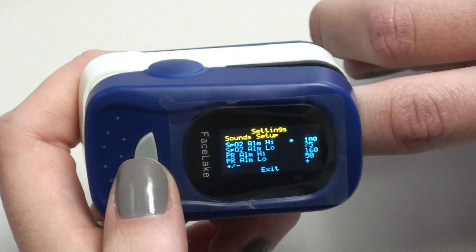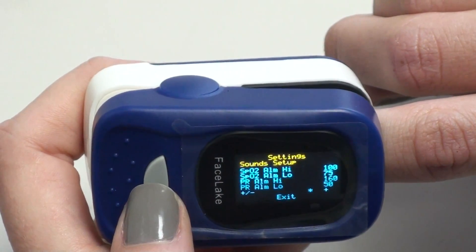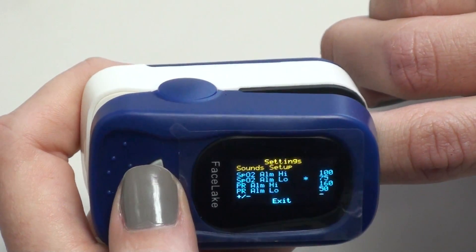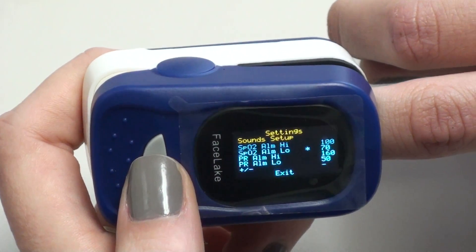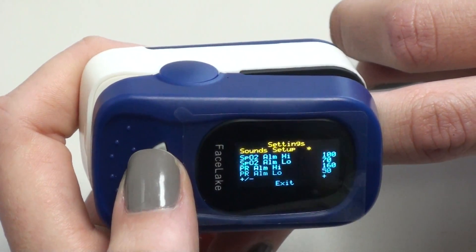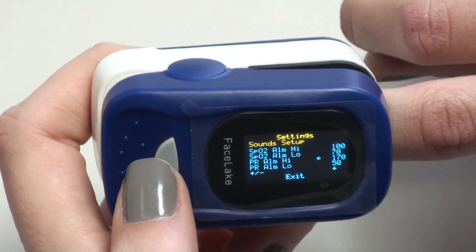We're going to keep the high at 100, but we want to change the low to 70. Go down to where there's a plus and minus option and hold down for a few seconds — you'll see the displayed minus. Go back up to the low and hold down until we get to 70. Then if we want to change the pulse rate high, go back down again and hold it down for several seconds until you see the plus sign. We're going to change the high to 170. This part moves in increments of five.